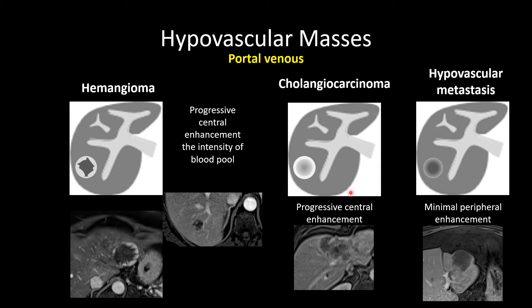For cholangiocarcinoma, there is also progressive enhancement, but that enhancement tends not to follow blood pool. Often in the portal venous phase, that enhancement will be actually less than the aorta. Hypovascular metastases can have variable enhancement — sometimes progressive central enhancement similar to cholangiocarcinoma, other times little to no enhancement. Also note that in this large intrahepatic cholangiocarcinoma, we do see capsular retraction, another classic feature of intrahepatic cholangiocarcinoma.